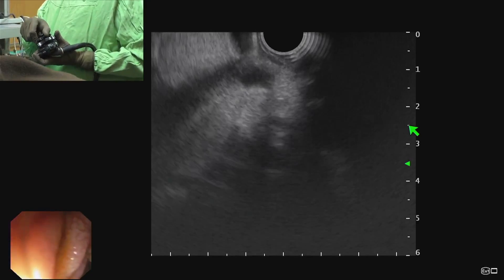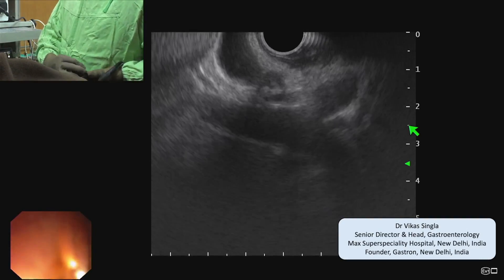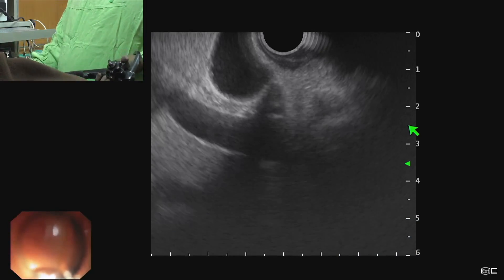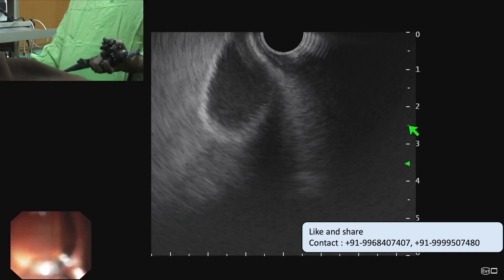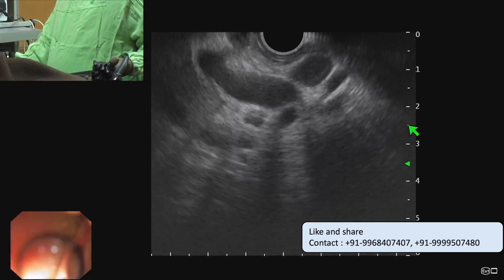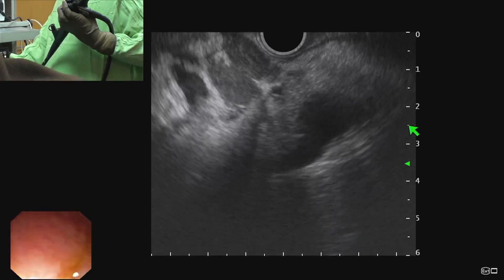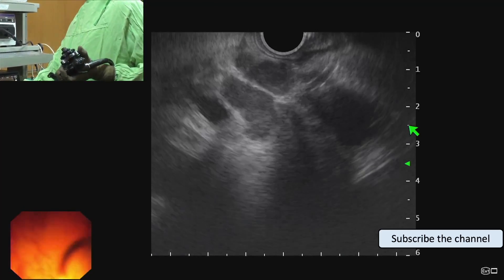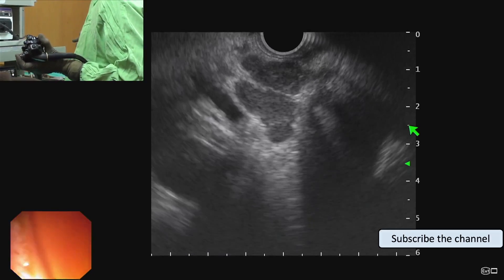That way we can see the liver, and we can see the gallbladder which is close to the probe. Now we are seeing a linear structure which is the portal vein. The area around the portal vein is the periportal area. Here we can see the gallbladder, the portal vein, and around the portal vein we can see various lymph nodes — here we can see a large node and conglomerating lymph nodes suggesting a diagnosis of tuberculosis.